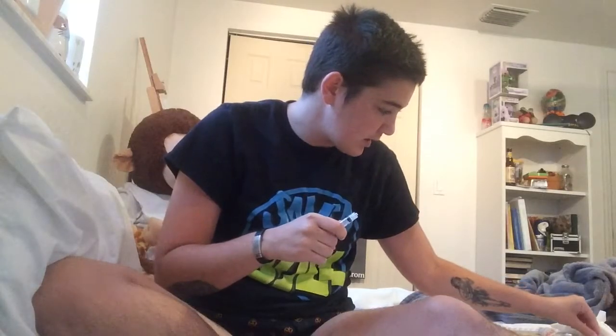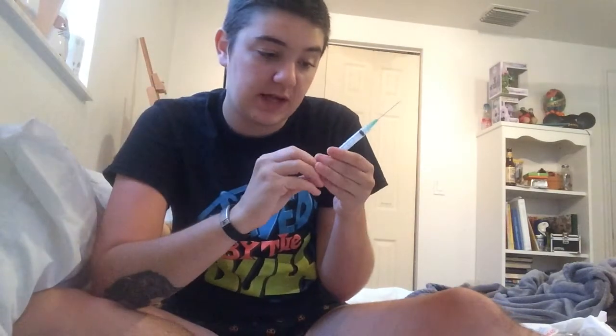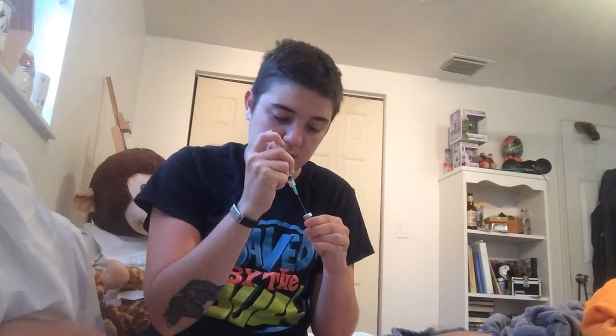So I have this one. I'm going to take this part off — you can see this needle — and set it aside on a clean surface, which I have ready. And then I'm going to take this one and put this one on. Whatever your prescription is, you fill your needle with that amount of air. So I have that filled with air and I'm going to stick it inside. You want to make sure it's actually inside — you don't want to touch the bottom. And now I'm slowly going to pull it up. Because there's air inside, the actual stopper thing is going to go higher than your prescription, so you have to watch where the medicine is.